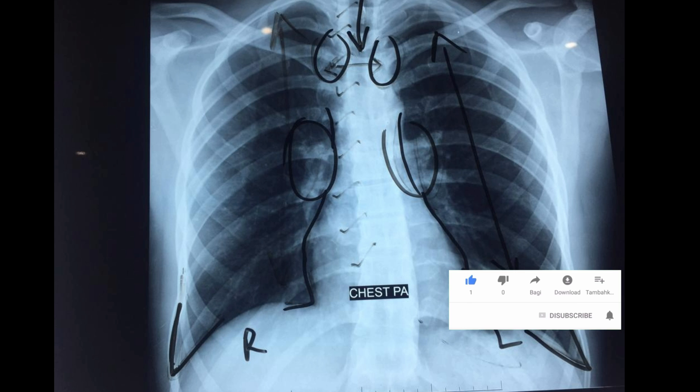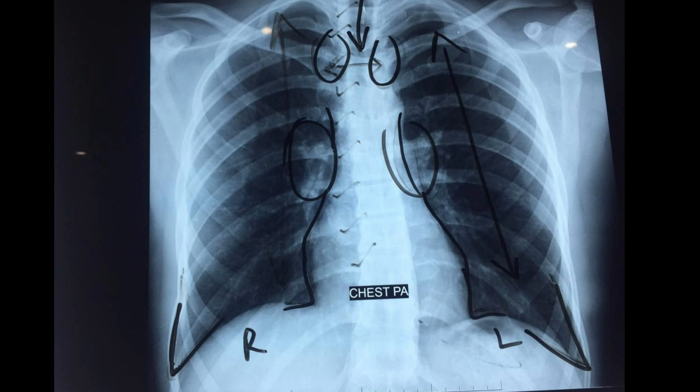Now for the interpretation: this is a chest X-ray of Mohammed Abbas, 28 years old, PA view, non-rotated film. Both lung fields are clear, costophrenic angles appear normal, cardiac size is normal, heart borders are prominent, and hilum appears normal on both sides. In this way you can interpret a chest X-ray very easily.